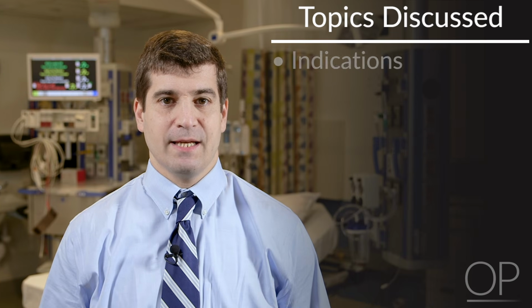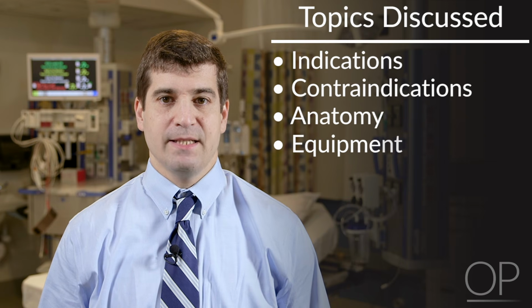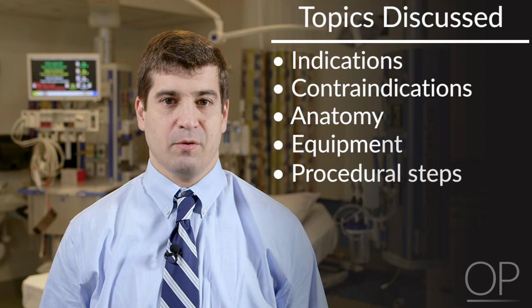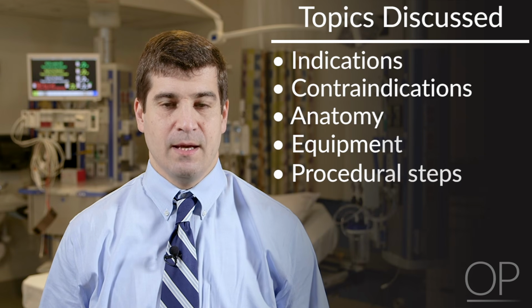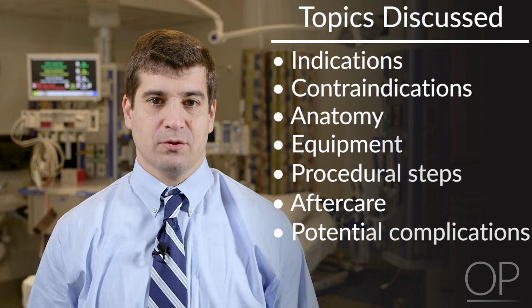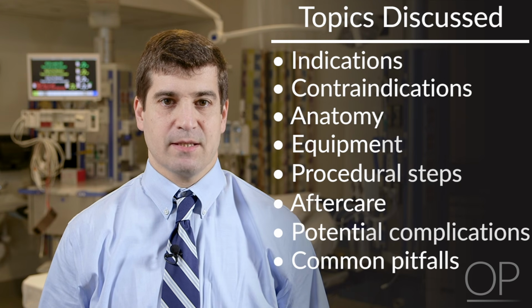This concludes this instructional video on pediatric orotracheal intubation. In this video, we reviewed the indications and contraindications for orotracheal intubation. We reviewed pertinent airway anatomy, detailed the equipment used, and demonstrated the steps required to successfully perform orotracheal intubation. Additionally, we examined appropriate aftercare, potential complications, and reviewed common pitfalls and strategies to address them.